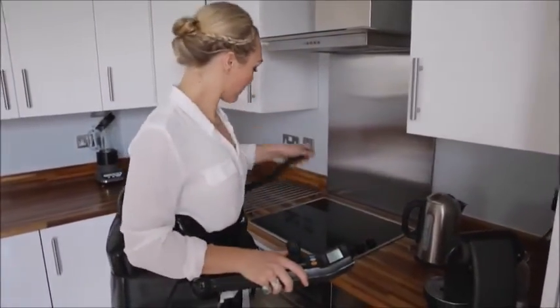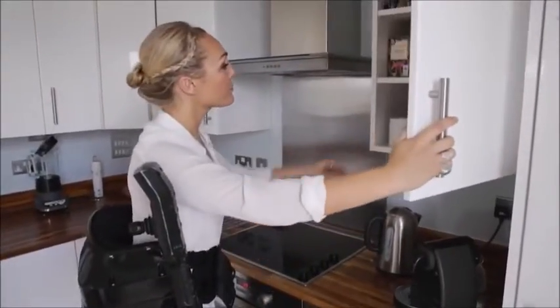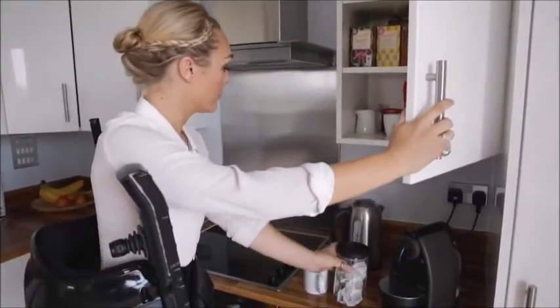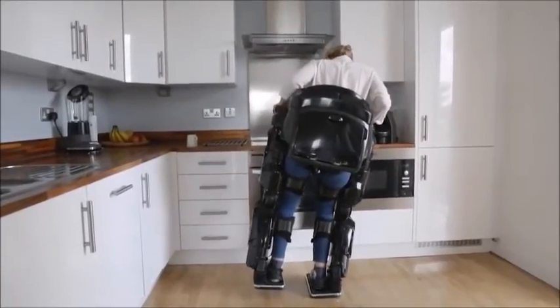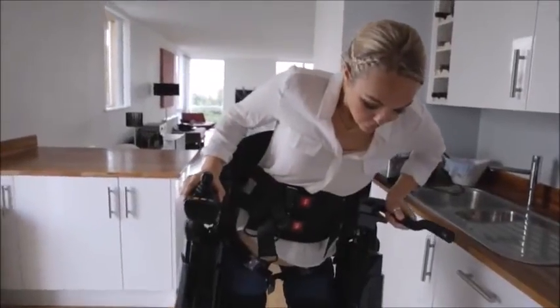I can also raise the arm rests, which leave my hands completely free for more important things, whilst being stable and balanced. It's also possible to shuffle from left to right. This is particularly useful for negotiating smaller spaces and helping stretch my hips, whilst I benefit from dynamic weight-bearing activities.